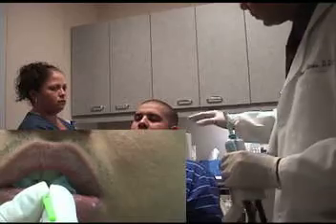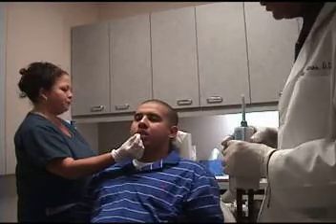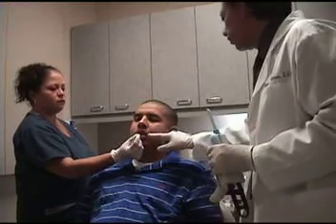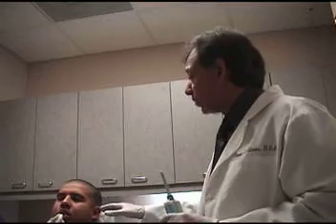And up to the right here, a little bit greater posterior interocclusal space. Okay, we're going to let that set, and then what you do immediately after this sets is check your autonomics, your reflex testing, to make sure that this position corrected that neurology. Because if it doesn't, there's not much point in taking an x-ray or doing anything.